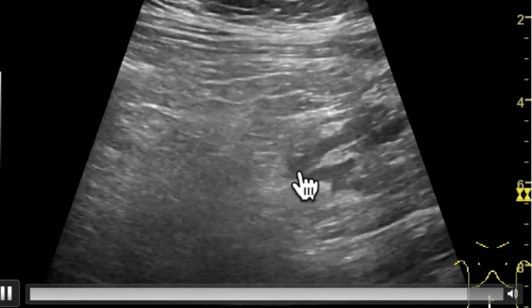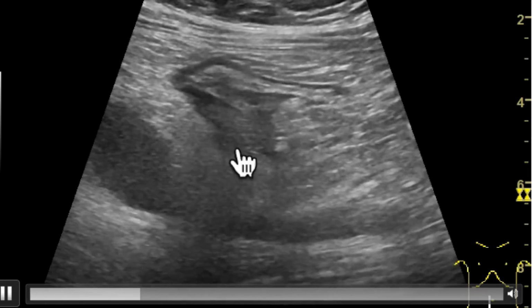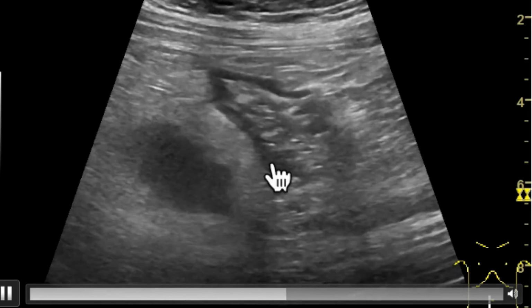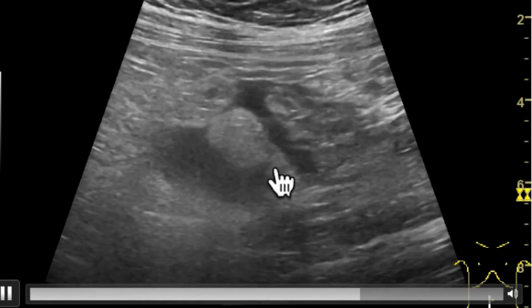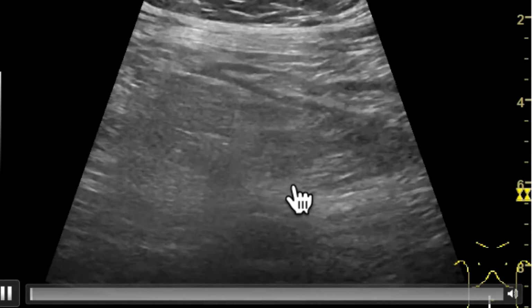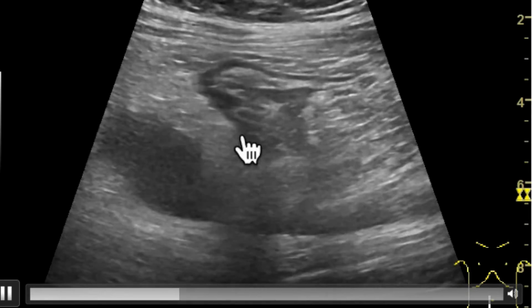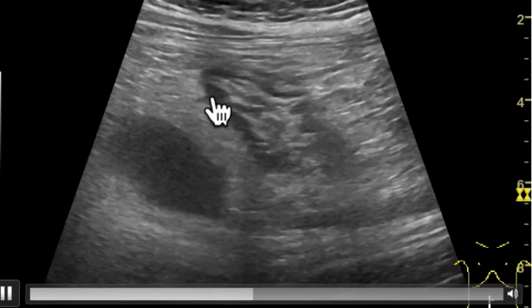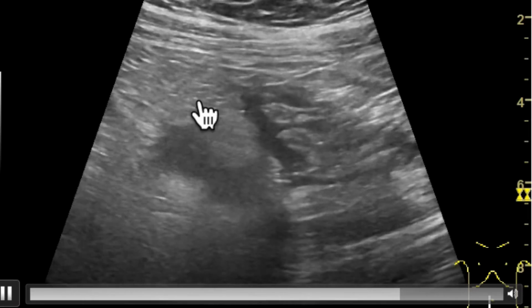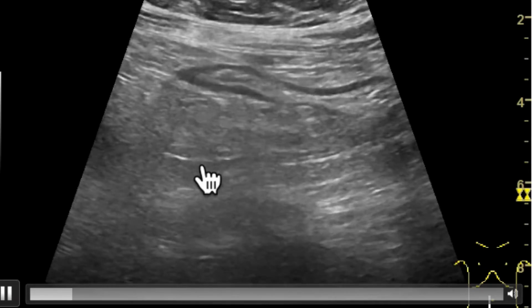Again, this is where the loop of bowel comes in. This is where the slightly thickened wall starts. The stratification appears to be preserved. But we clearly see a surrounding reticular reaction. This is a normal wall, which is thicker here. The echo-rich submucosa, the echo-poor muscularis propria, the surrounding reticular reaction. And in this surrounding reticular reaction here, we see an echo-free area, an echo-free formation.